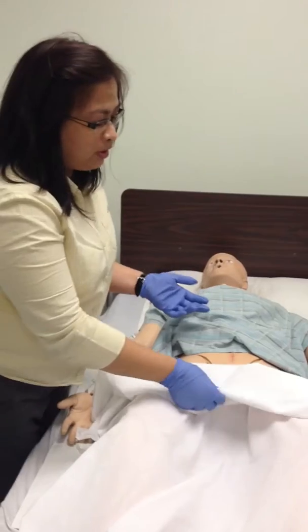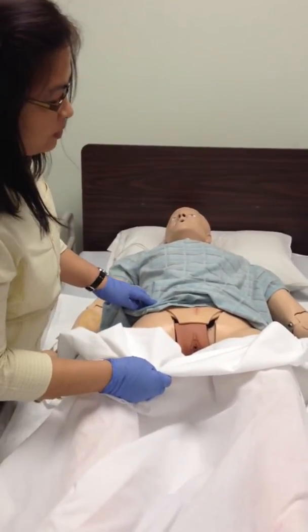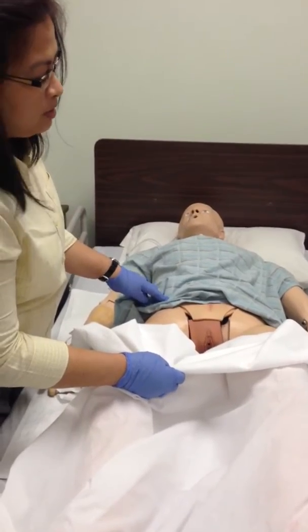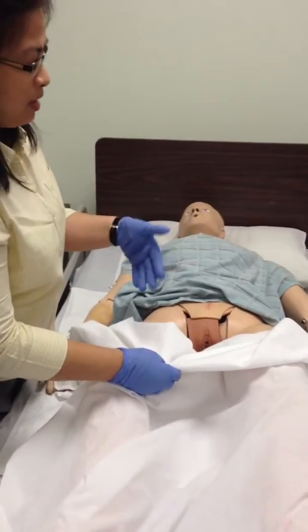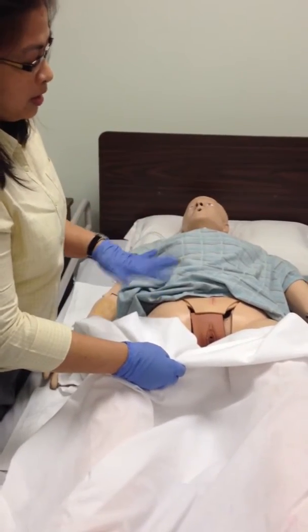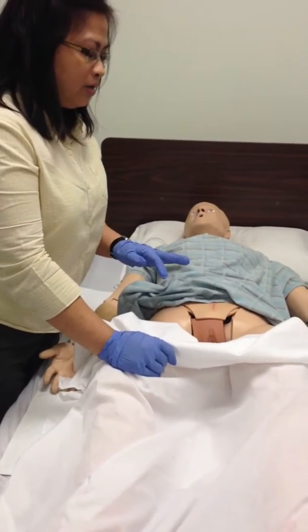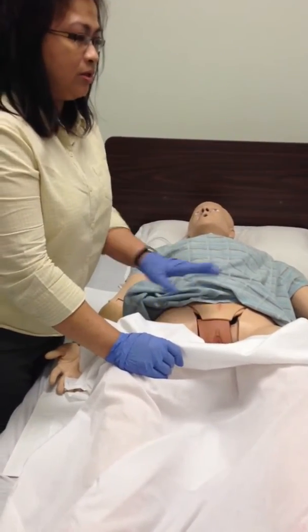So next, you're gonna go over here. I'm gonna check if I need to do perineal care. I did perineal care, you know, washing with warm water and soap. Okay, I did it this early morning. Okay, she's okay. And also, they might ask you where's the bladder?